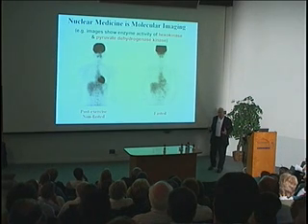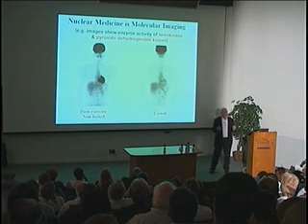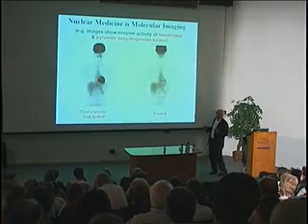So I present this now as a different mode of using the discovered radionuclides. This happens to be an analog of glucose. And it goes into the heart as a function of how much blood flow there is to heart muscle. But also, it goes in based on what enzymes are active. So this is about the best example I can give of why nuclear medicine is molecular imaging, and it's imaging the activity of enzymes.